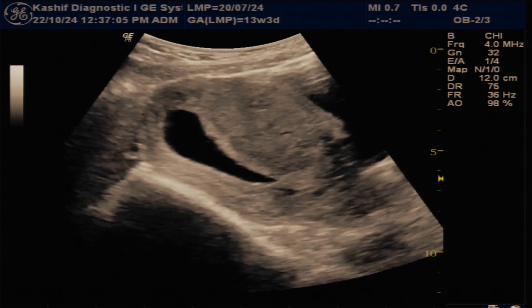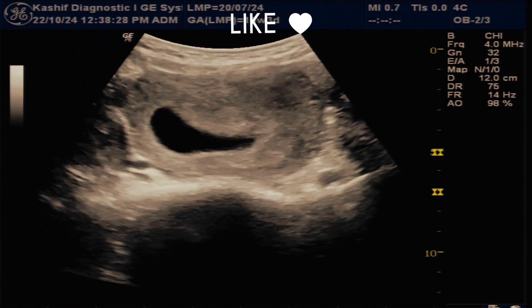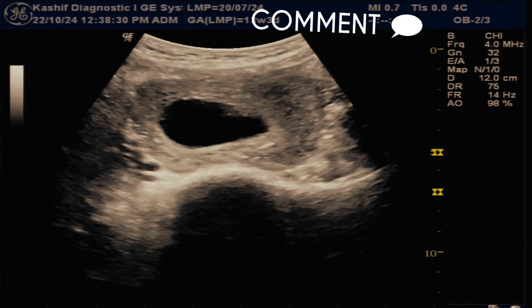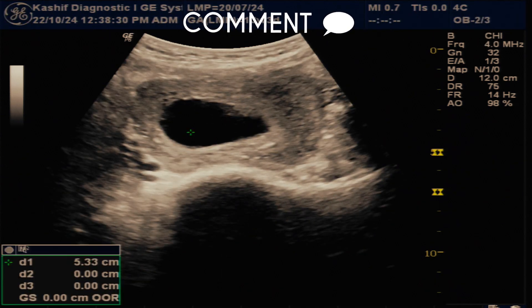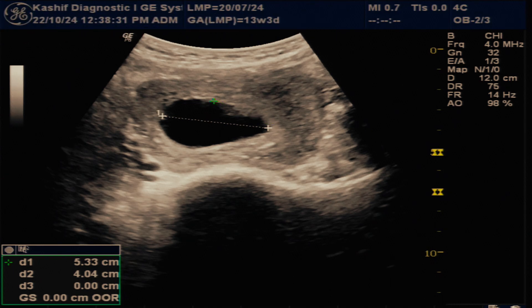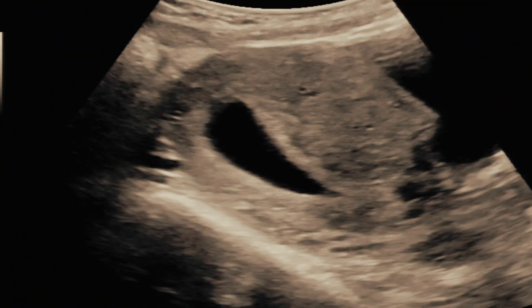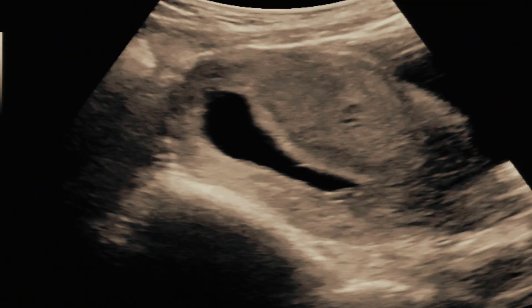The gestational sac is mildly elongated. The mean sac diameter is 38.7 mm, corresponding to a gestational age of 9 weeks and 1 day. There is no yolk sac and no fetal pole seen within the gestational sac.